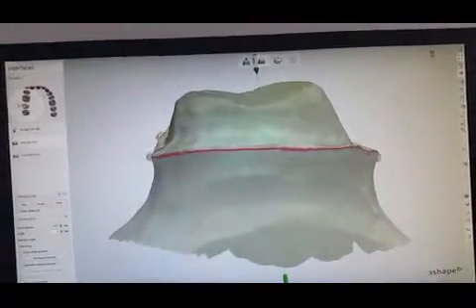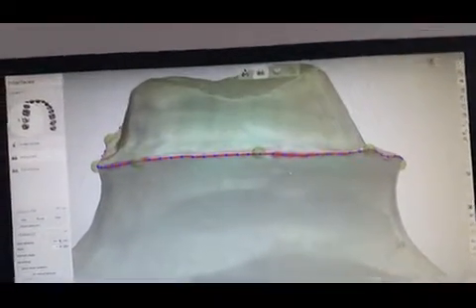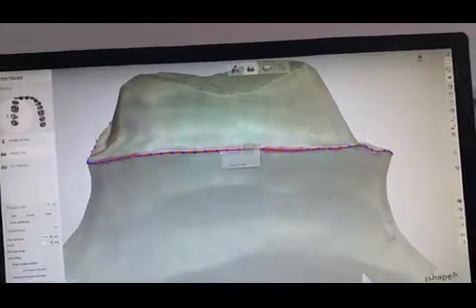Now it's telling me to pretty much identify the margin. I'm going to go into a little bit more detail here. There are two options.